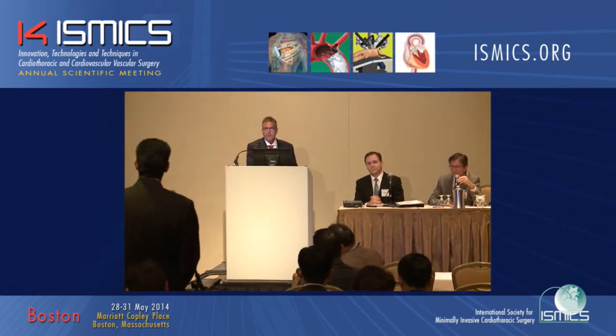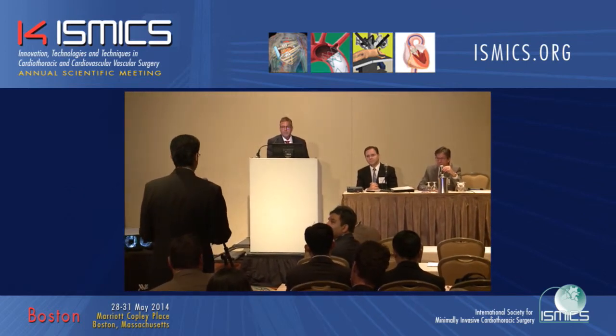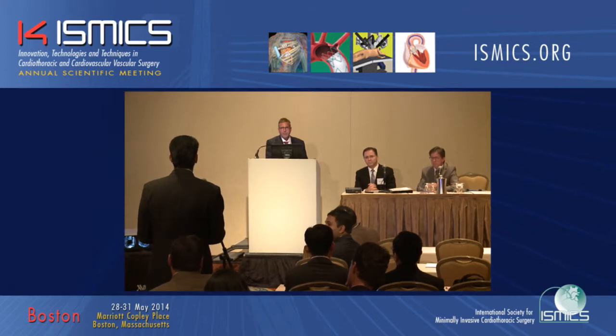Netu Sarkaria from New York. We've been using this for some time and found it very useful in broad areas with raw surface, such as an extrapleural pneumonectomy or decortication or something like that. I guess my question, which has partially been answered already, is where have you been seeing the blood loss? Is it during the subcarinal lymph node dissection? What were the nature of these operations? And how have you been using it differently to alter the way you use electrocautery?